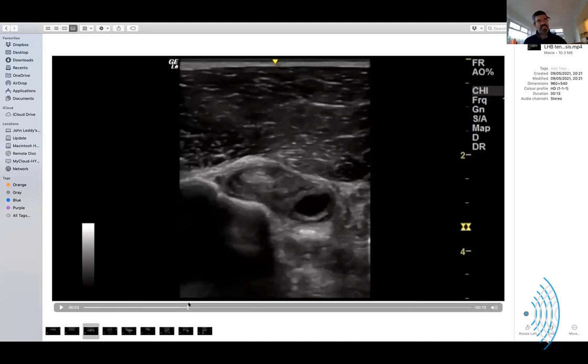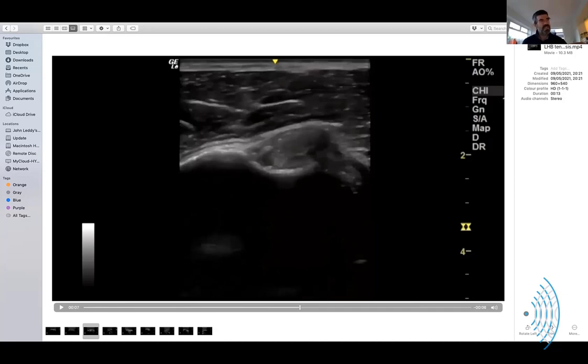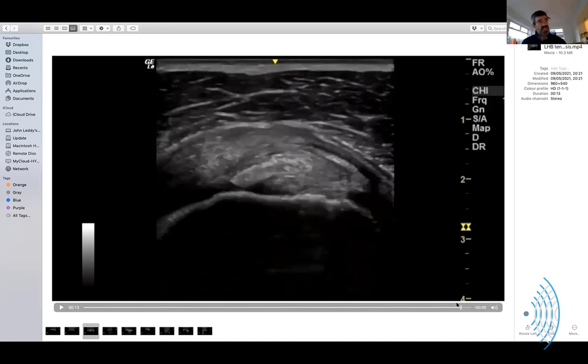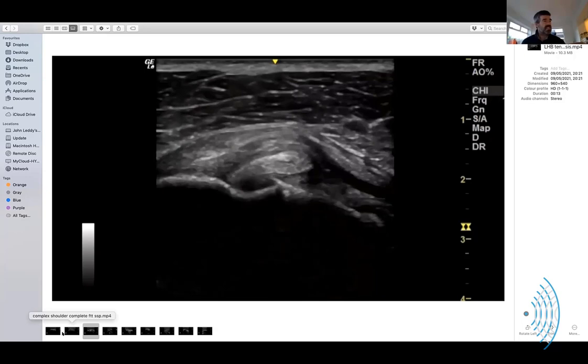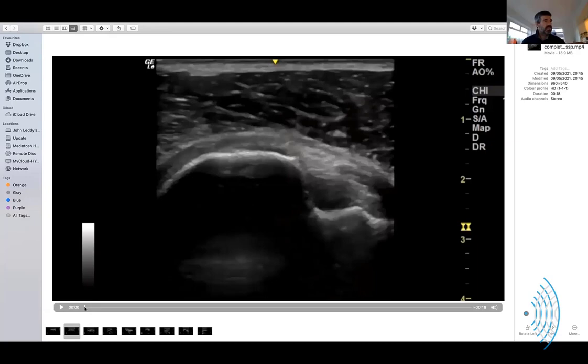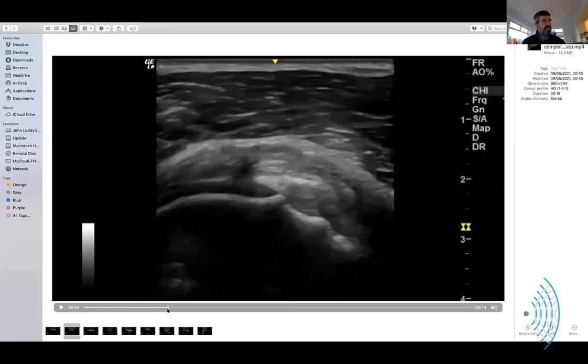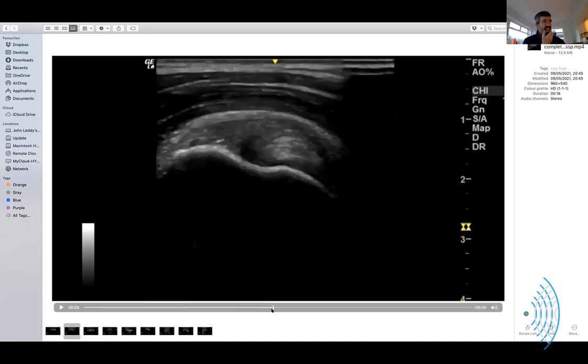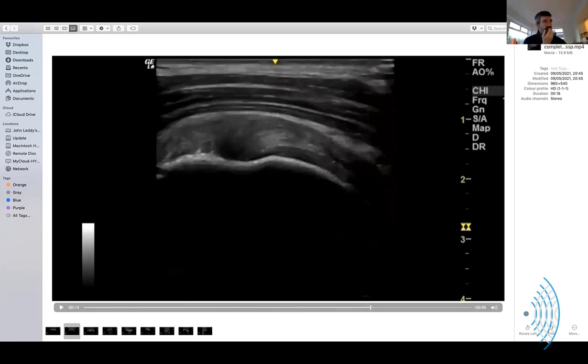Soft tissue, some proliferation of soft tissue, some old synovium maybe that's gone rusty, and the biceps is sitting there. The biceps is quite bulky as it goes around that corner, and normally as it comes out there you should see some subscapularis, which I'm not really seeing. This is the same biceps. You can see the supraspinatus. That's where the supraspinatus should be sitting. Yes. The supraspinatus is not there. Cartilage there. Sorry, I'm just chopping clips. Not quite sure what I was trying to show.